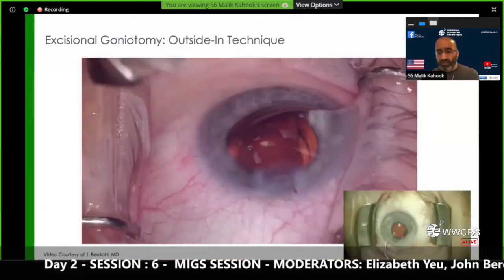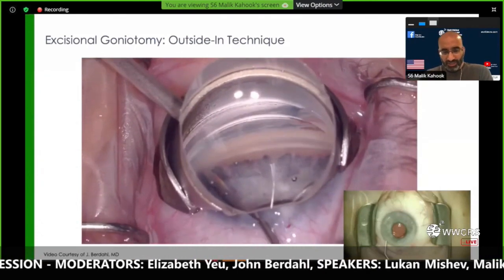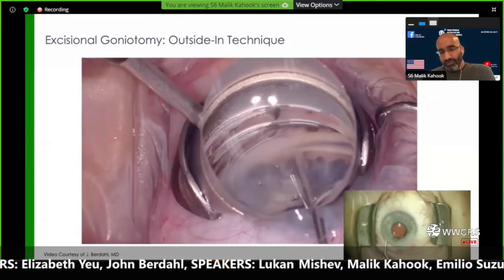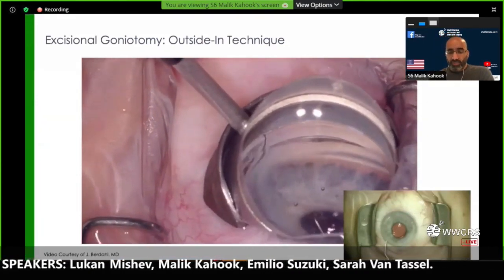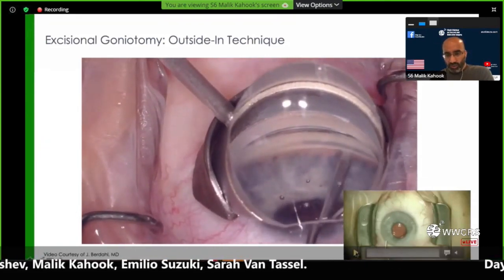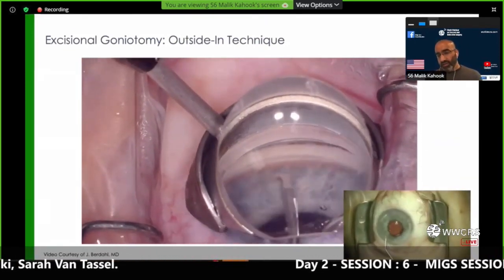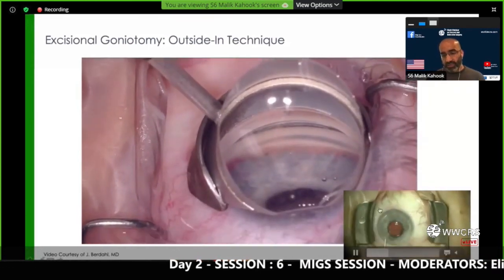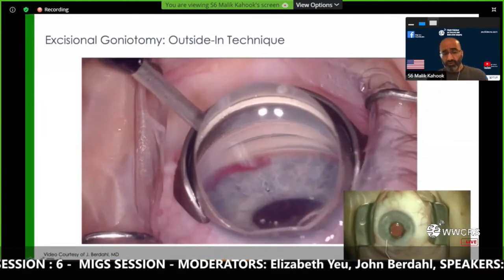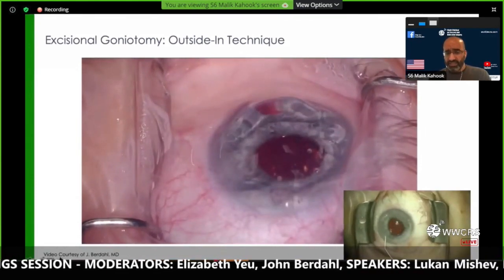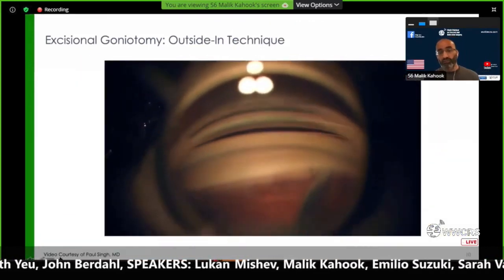Here's my friend VJ Berdahl doing a case of KDB—I think this is his first case. You can see going from left to right creating this partial excision of the trabecular meshwork and then from right to left. In the bottom video he goes in with duet forceps to remove the strip. I would encourage everybody doing MIGS or angle-based surgery to do this fluid wave at the end of the procedure. You can see the wave that removes the blood from the vessels, and that tells you that you've successfully unroofed the canal.